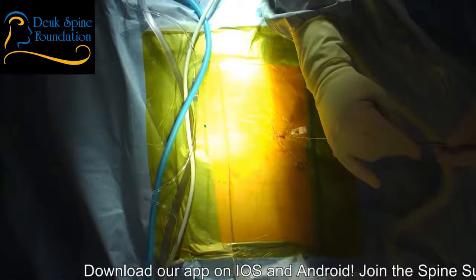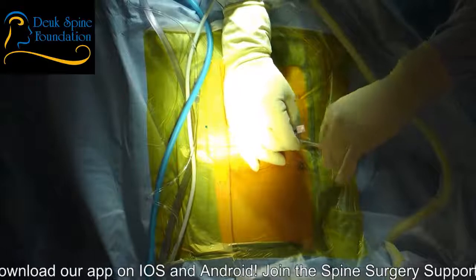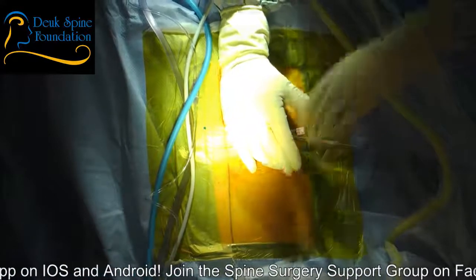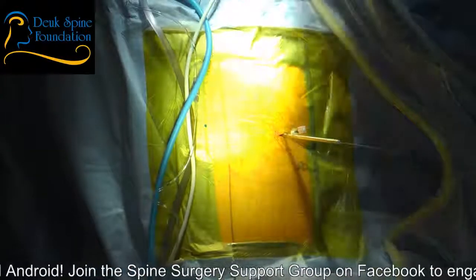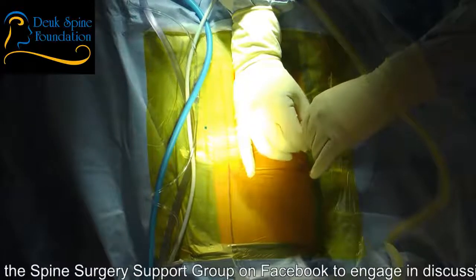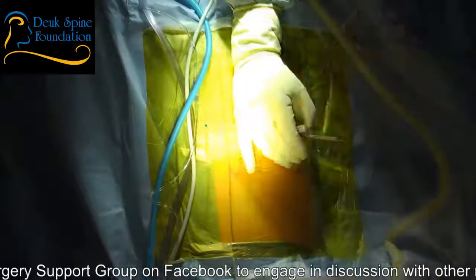And this dilator is going to spread the tissues. It will not damage the tissues. It will spread them. Spread them means just separate them without hurting them. So the tip is right at the facet joint. I'm going to go past the facet now into the foramen.